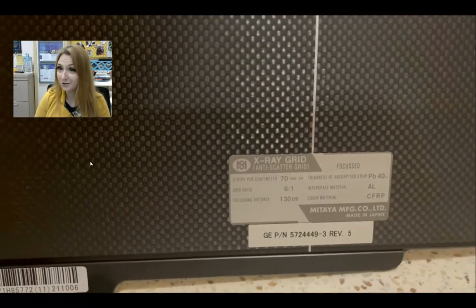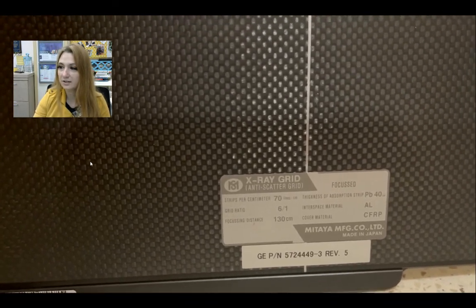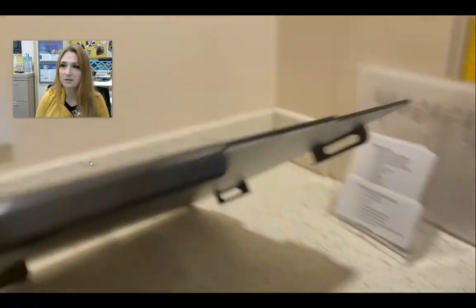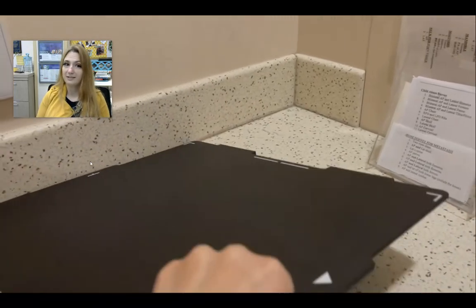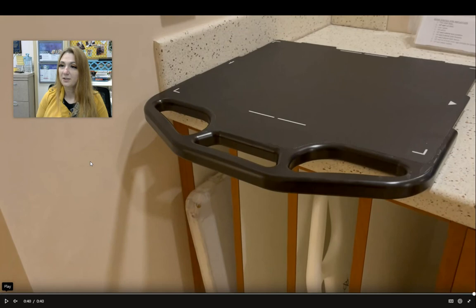It looks similar to this black grid, and if you want to make sure that it's a grid, flip it over, and again, on the underside of it, you're going to see the details that, first of all, clearly identify it as a grid, as well as telling you a little bit about the ratio. You'll also notice on this one that it helps you with those centering lines as well, because we don't want to be off center with something like a focused grid.